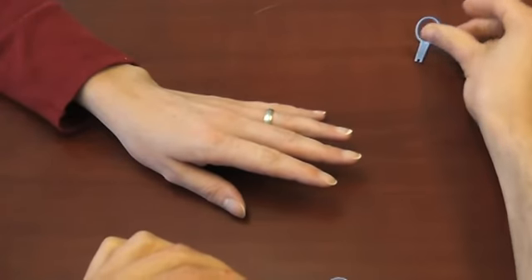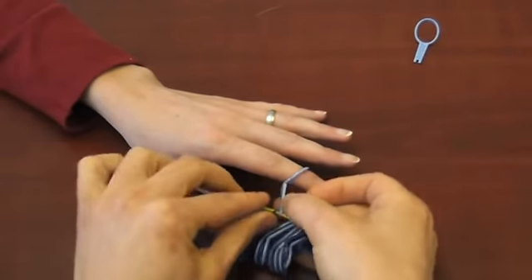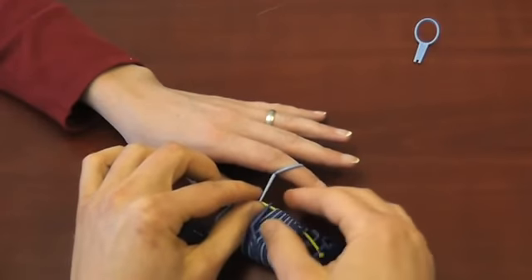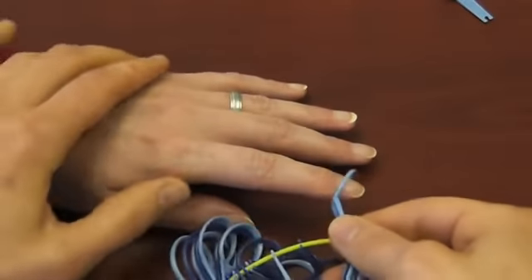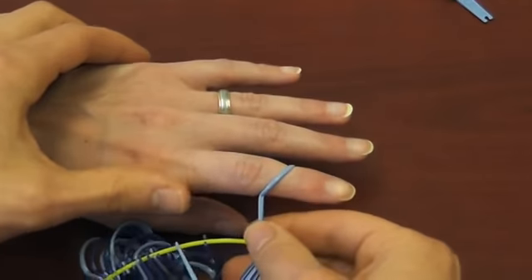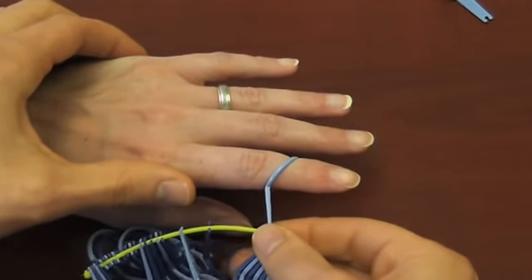Follow the same procedure for the distal ring, to find a snug but comfortable ring that will rest in the opposite direction, approximately 5 millimeters from the joint, and at about 30 degrees. Then detach the distal ring size from the cord.